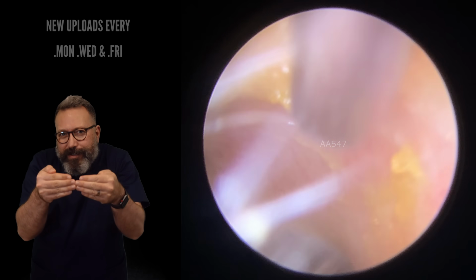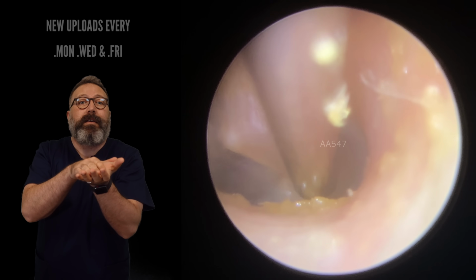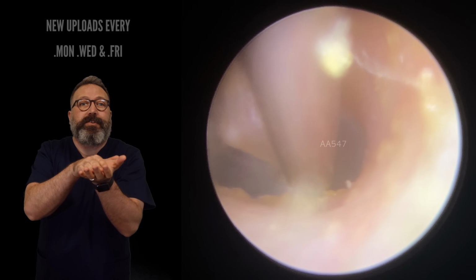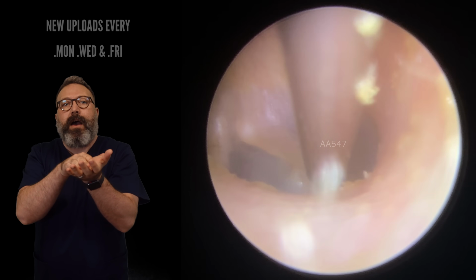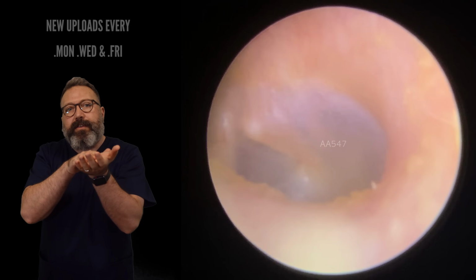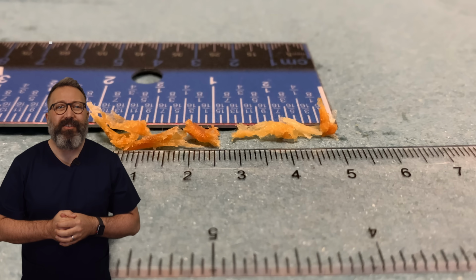Looks like sunrise, just coming over the top of the anterior recess. So we're just going to go over and nip that little bit away. There you go. You can just see a couple of little cilia just dodged into my view there. But just taking away that little bit. Let's look at the eardrum. Good look at the eardrum. Light reflex is present. Look at that.